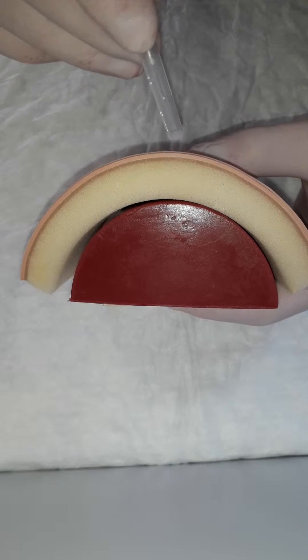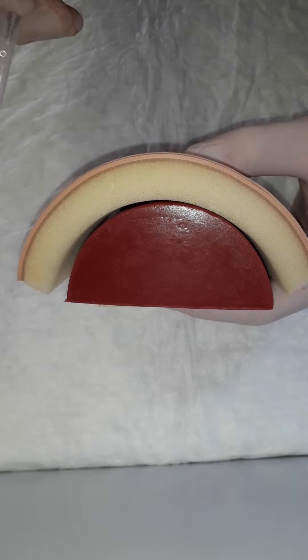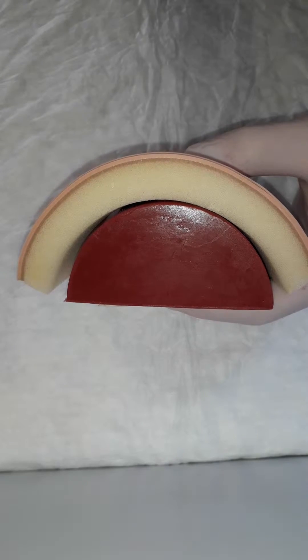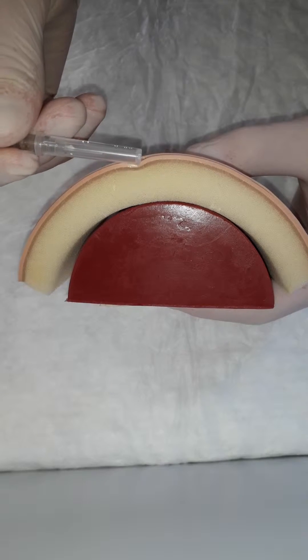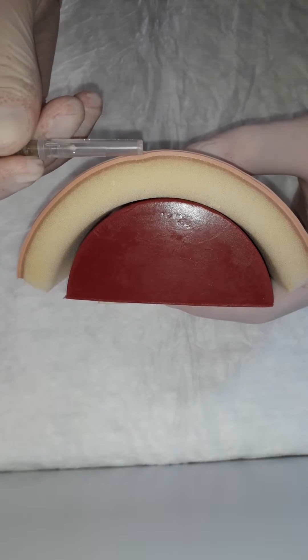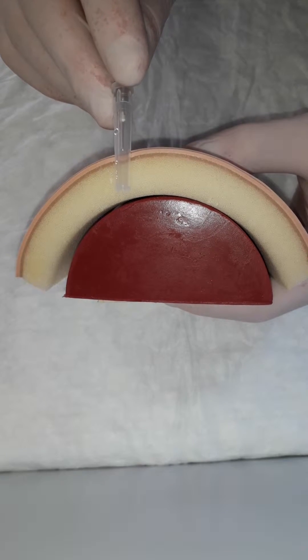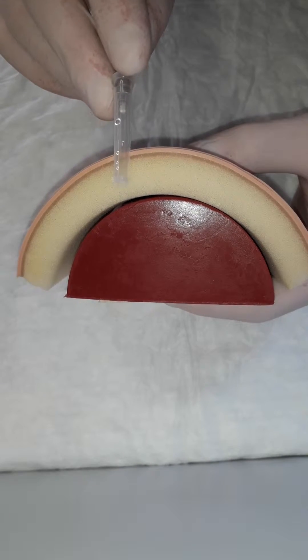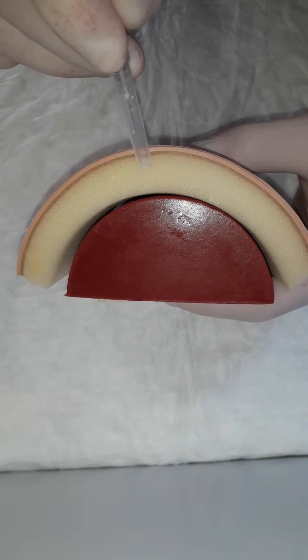So it's very, very thin. When we try to inject our medication intracutaneously, we will use a very narrow angle — just 10 degrees. Why? Because if you increase your angle to, let's say, 45 or 90 degrees, your needle tip is already at the level of subcutaneous tissue, which is a mistake.